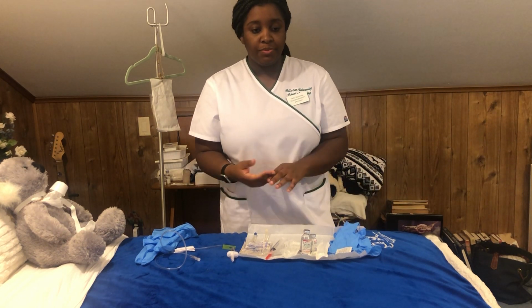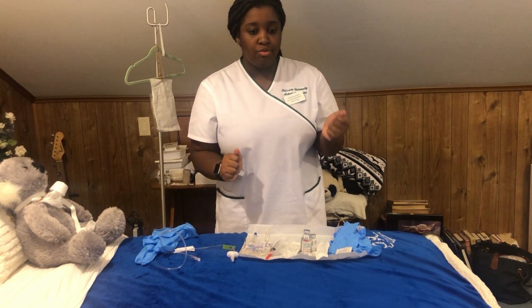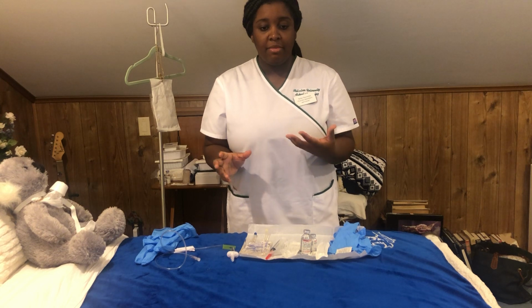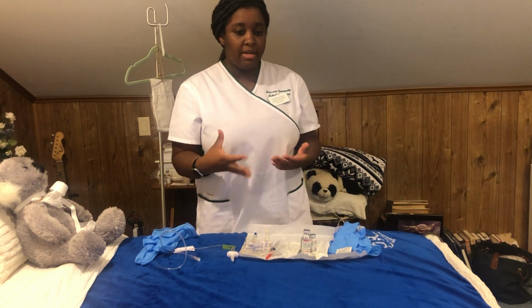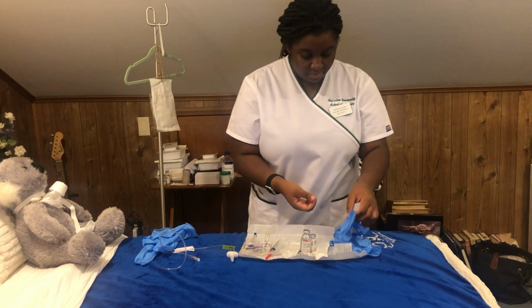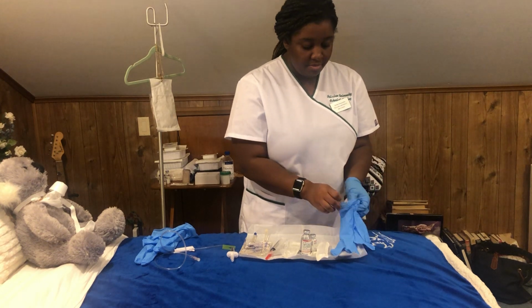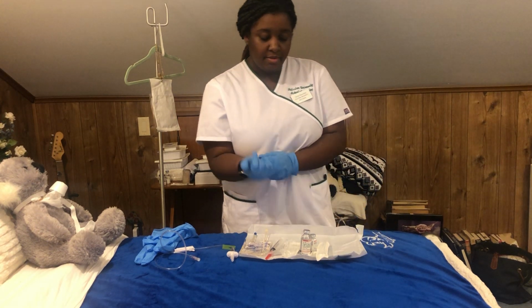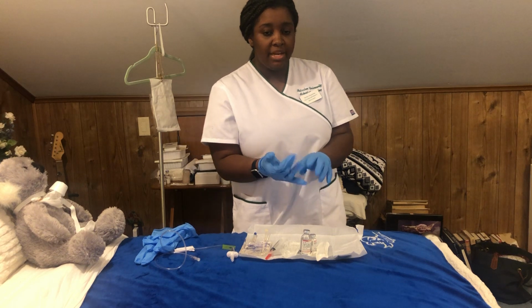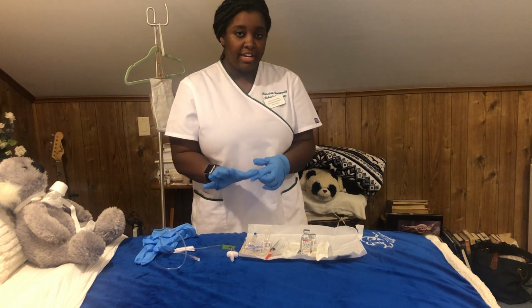Okay, so I have all of that, and I'm just going to assess the patient's existing IV lock and making sure that the site, there's no edema, no redness, tenderness, or pain. Okay, so at this point, I will don on my gloves again, a new set of gloves, and I just want to do the additional 5 rights. So it's education, patient education, assessment, evaluation, documentation, and the right to refuse.